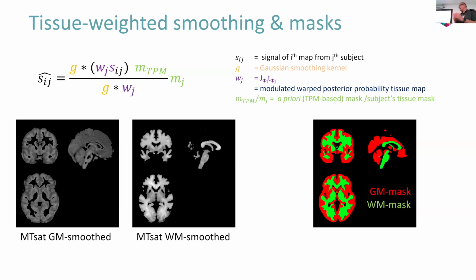And you would do your GLM for the gray matter and the white matter separately. And because we have actually 4 maps, you would do that for each and every map separately, R1, R2, PD, and MT. Hence, the potential issue of multiplying the number of GLMs that we are doing and the risk of false positives.